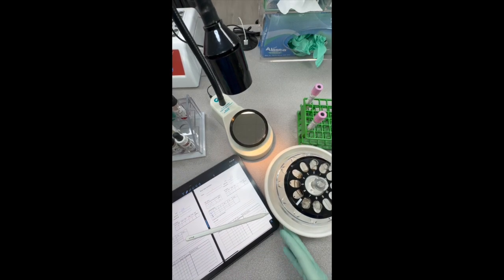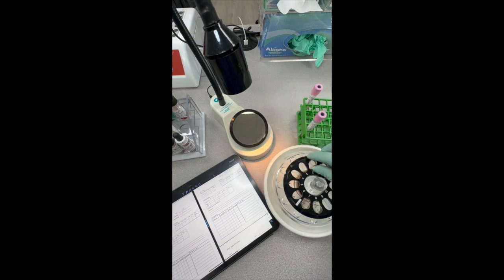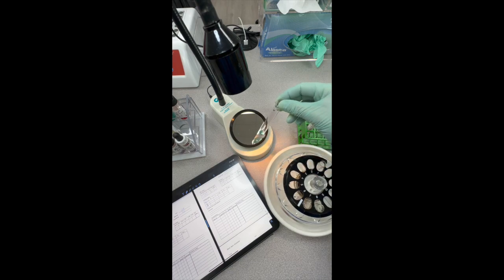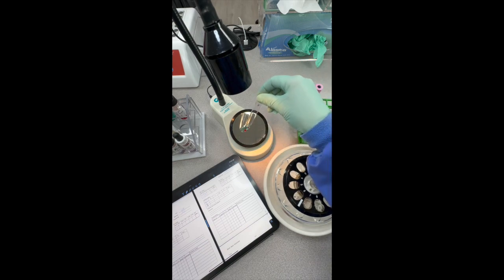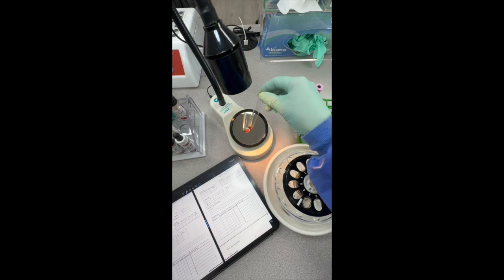Okay, very good. Now we're back. We're going to read our check cells, and make sure these are positive. And oh, it's not coming up very strong with my check cell. I'll double check that one. Let's see what this one looks like. We may have to add one more drop. That's our D. That's what we got positive. We'll go ahead and move that over there. Let's see. Oh, there we go. That's a really nice one there. These ones here are a little weaker.